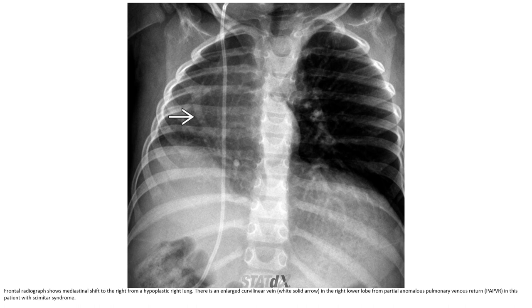Frontal radiographs demonstrate mediastinal shift to the right from a hypoplastic right lung. There is an enlarged curvilinear opacity in the right lung from the partial anomalous pulmonary venous return in this patient with Scimitar Syndrome.